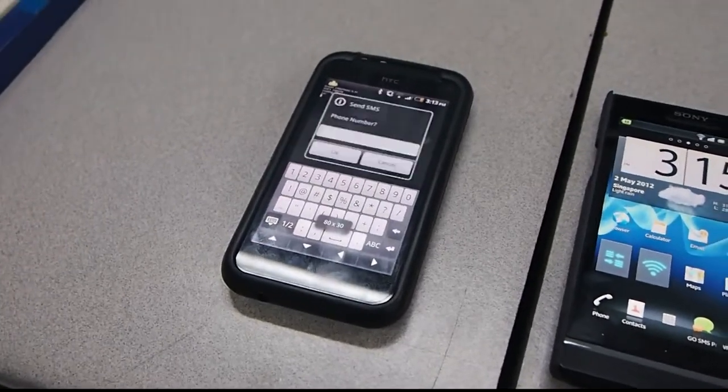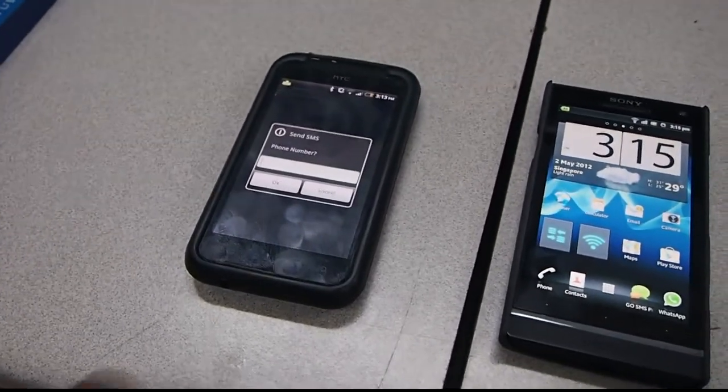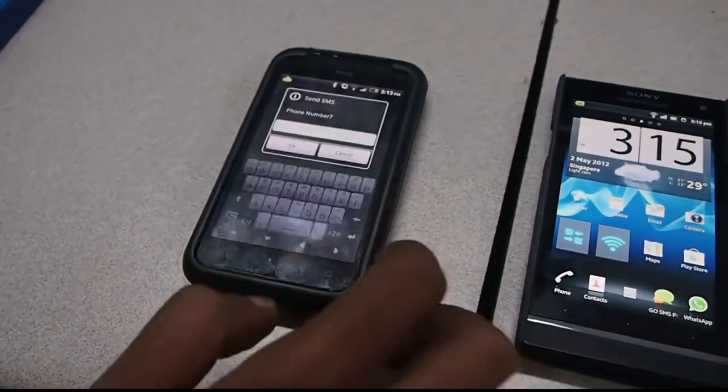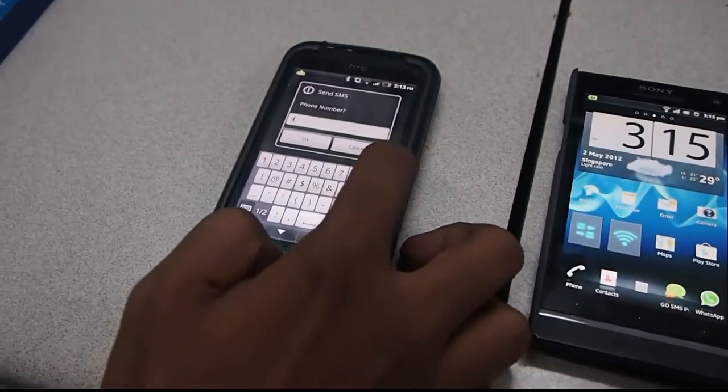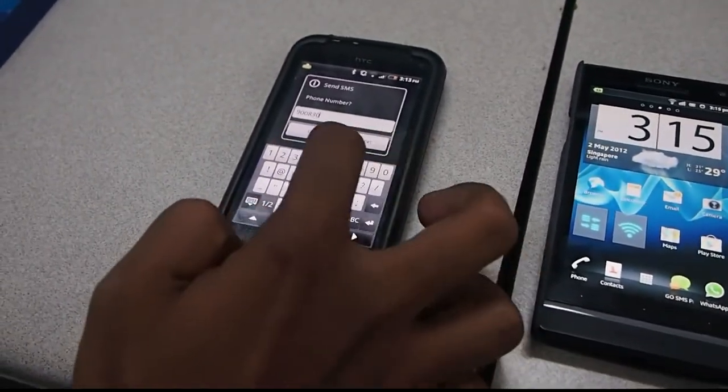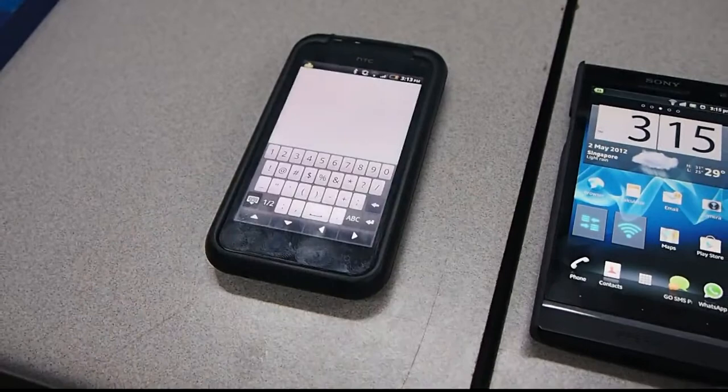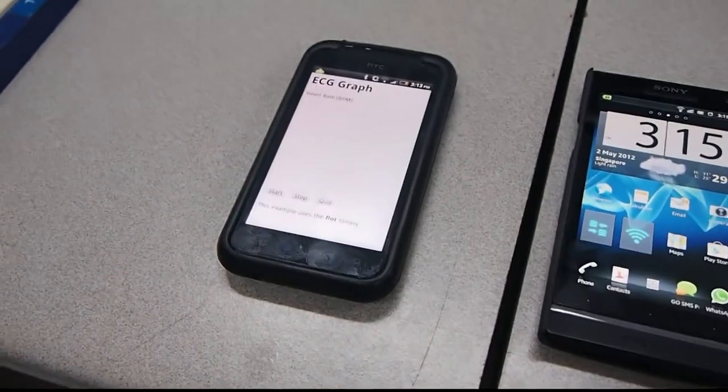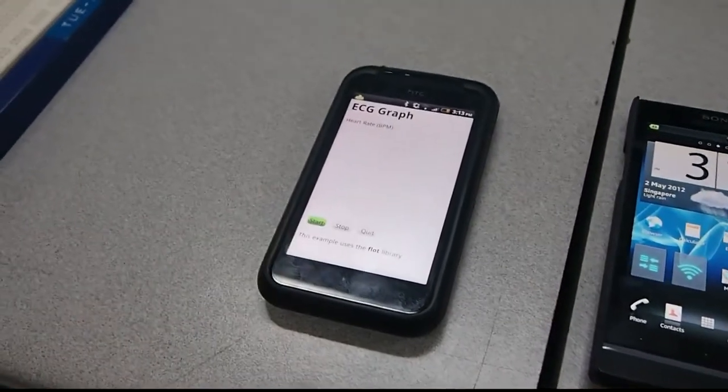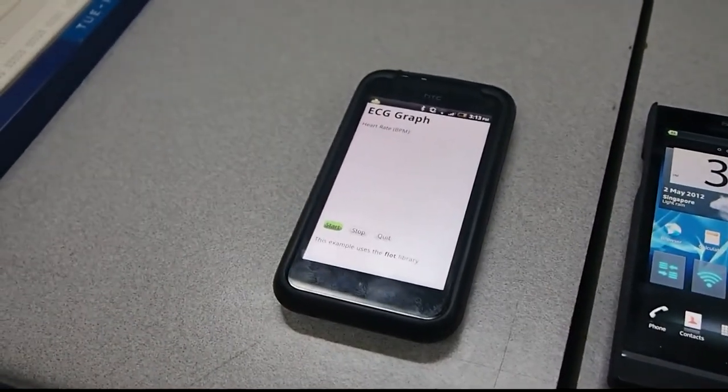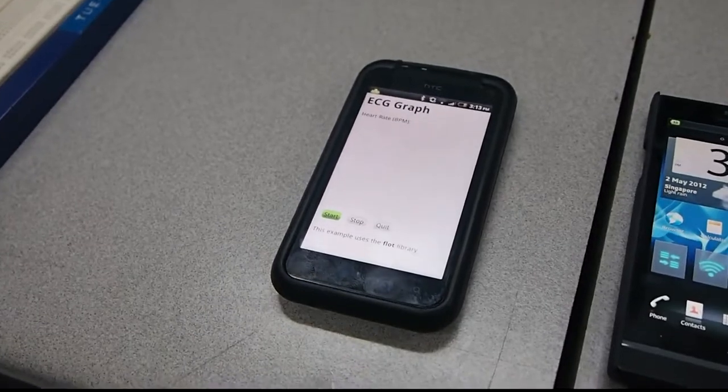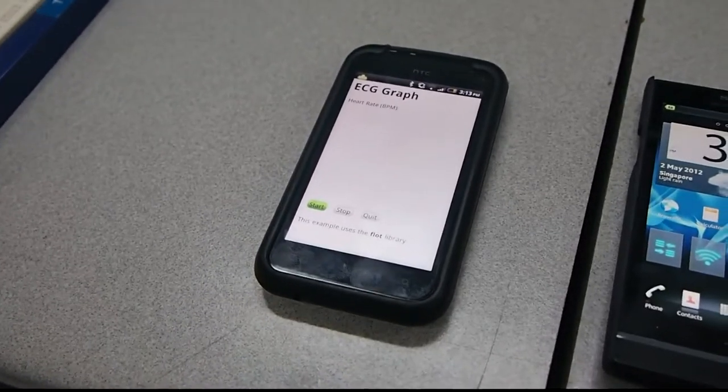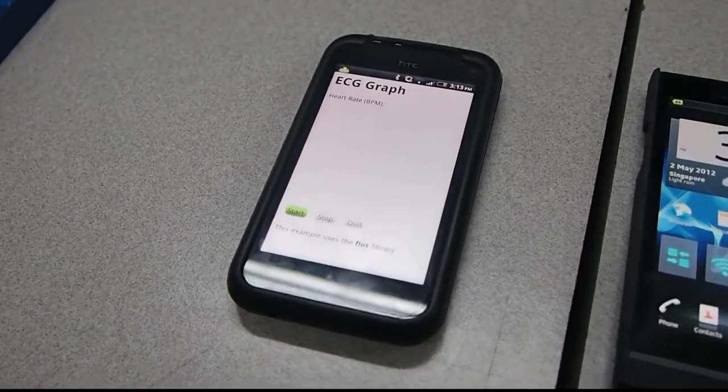It's going to prompt me to enter a phone number, so I'm going to enter a phone number. If I click start now, it's going to measure my friend's heart rate and at the same time a waveform is going to come out.